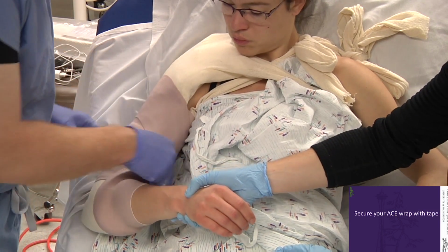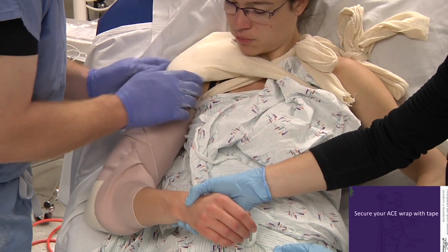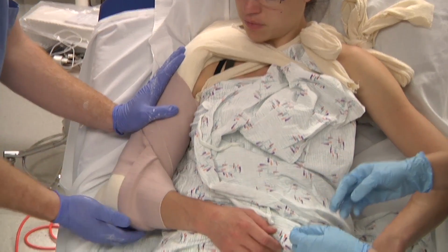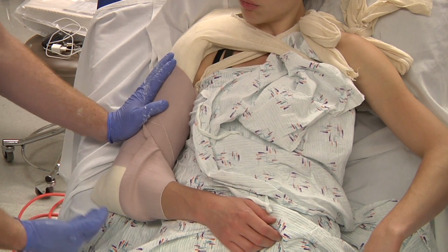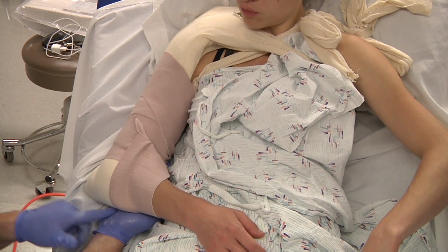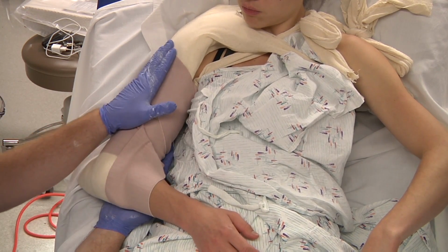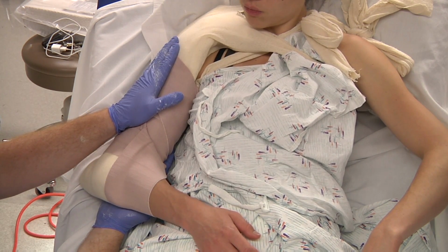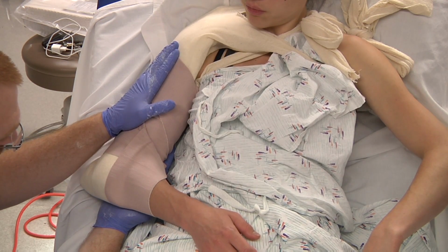And then from here, you can simply tuck your ace wrap in or tape it if you have it. We avoid using any metal prongs here as they can migrate and cause an issue. So keeping the plaster on the lateral aspect and on the medial aspect. Generally, these fractures in obese people or people with big chests fall into a significant amount of varus. So a valgus load is applied up high, and on the inside of the medial elbow, distributing the weight with the palm of your hand, the broad surface, to not create any indentations or ripples. A valgus force is applied while the plaster sets, making sure that your plaster ends up high, and you hold that until your plaster is dry.